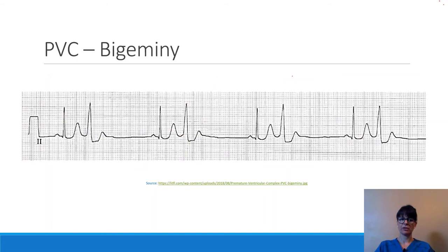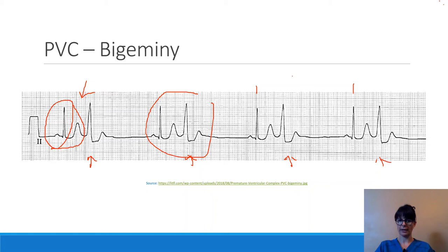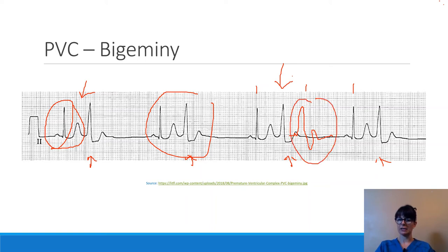Here is an example of PVCs in bigeminy. We see a normal beat, then a wide and bizarre beat — every other beat is a PVC. The PVC occurs early in the cycle, before we would normally expect the next beat. Between the PVC and the next normal QRS, there is a pause, because the PVC fires prematurely rather than at the regularly expected interval.